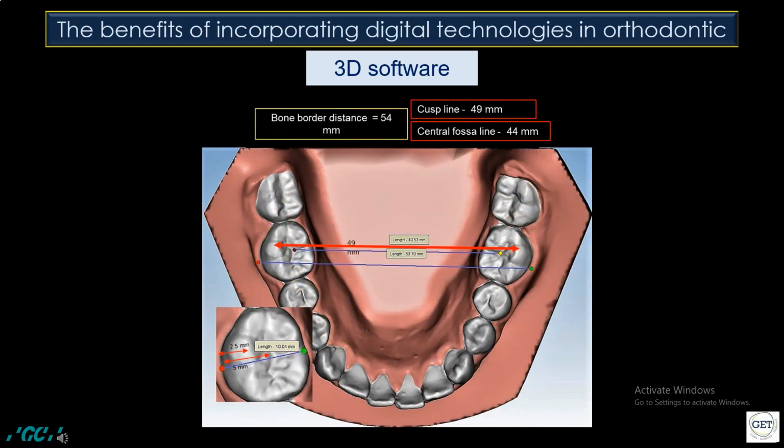Here we can see a sample of a calculation easily done in order to relate the teeth's current position in relation to the bone, calculate the lateral required teeth movement, expansion of the lower arch, and accordingly calculate the upper teeth position. And of course choose the correct wire size perimeter accordingly.